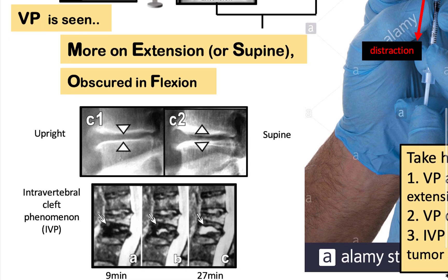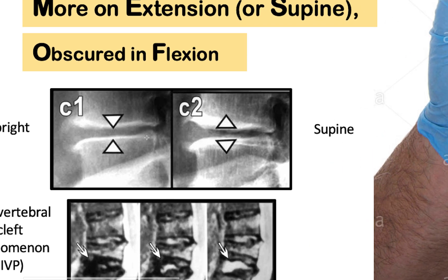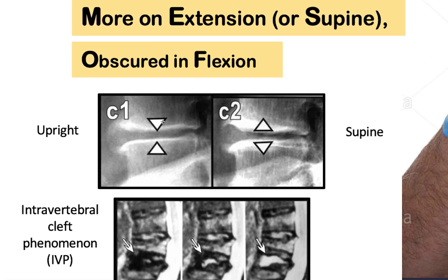Now let's look at some examples. These are sagittal CT images of the lumbar spine in which we can see that there is joint degeneration in the form of end plate sclerosis. We have osteophytes here and decrease in the height of the intervertebral discs. In the upright position, the vacuum phenomenon is hardly seen. However, in the supine view where there is distraction forces from the paraspinal muscles, the vacuum phenomenon is better delineated.